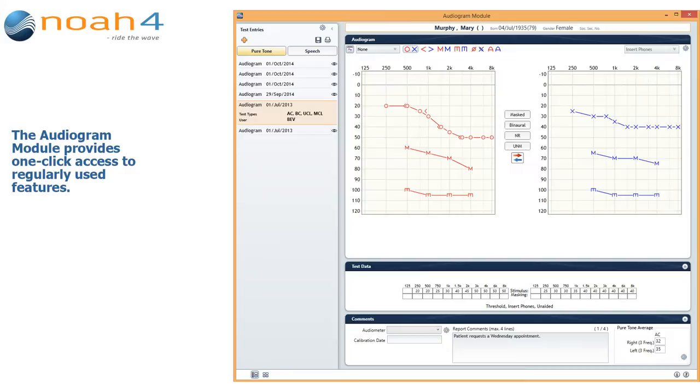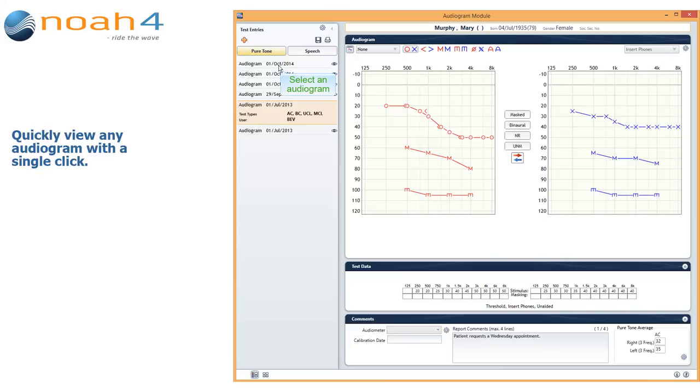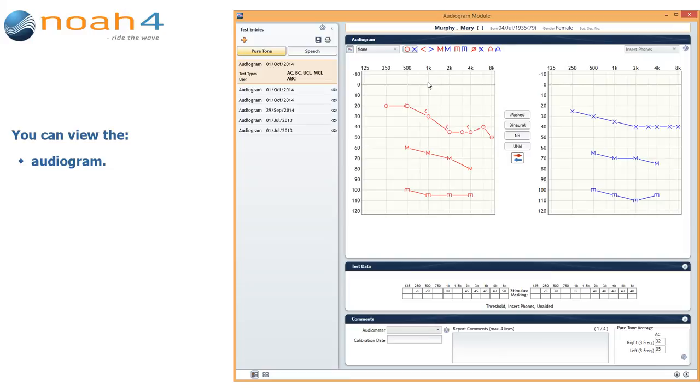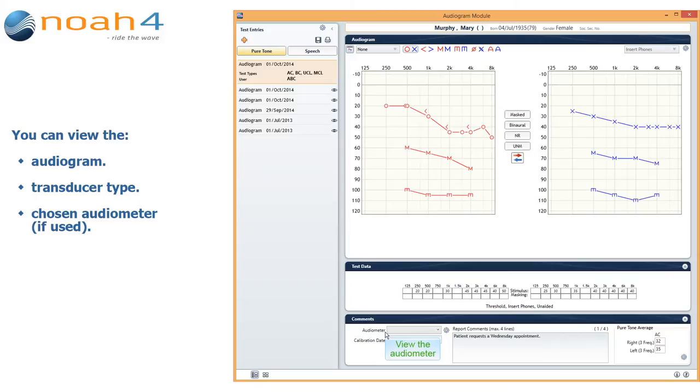The Audiogram Module provides one-click access to regularly used features. You can see a list of all the patient's audiograms in the left column, and you can quickly view any audiogram with a single click. You can view the audiogram, the transducer type, your chosen audiometer if you have used one, your added notes, and the pure tone average.